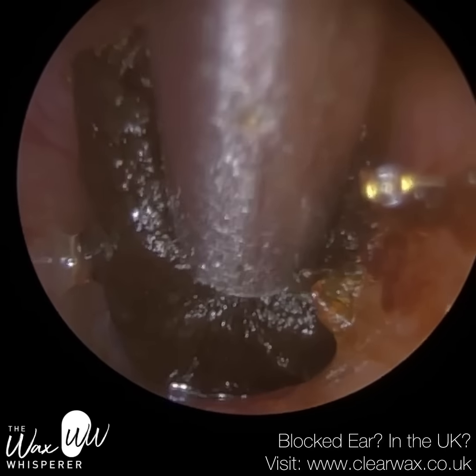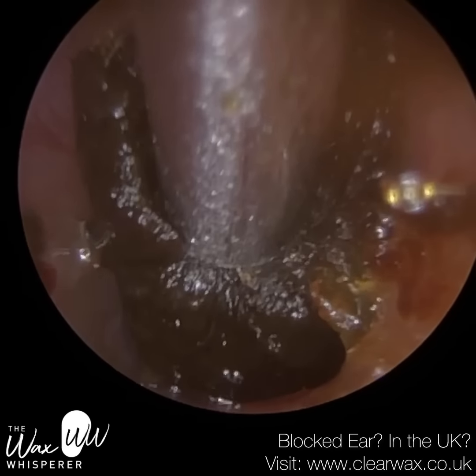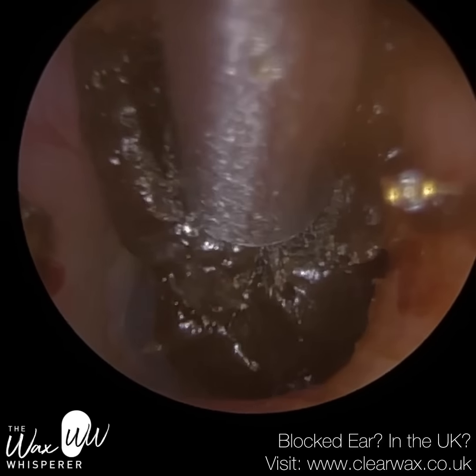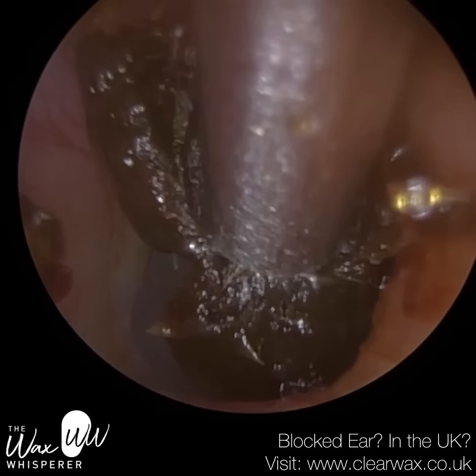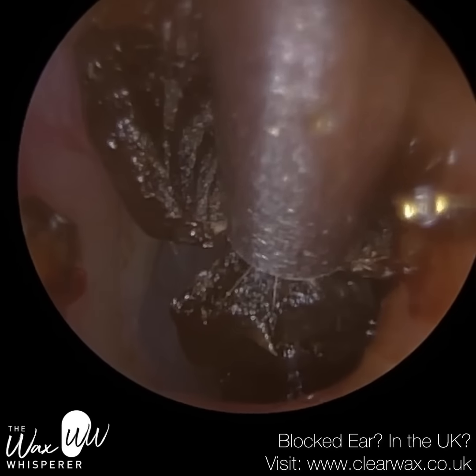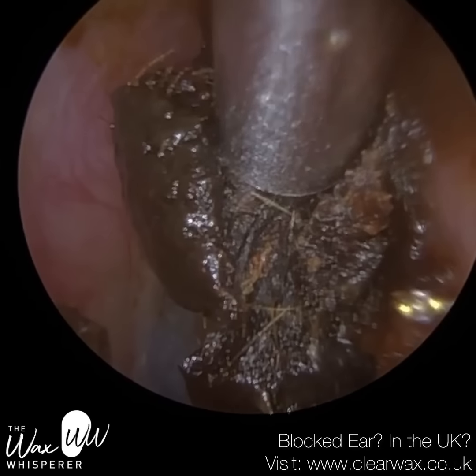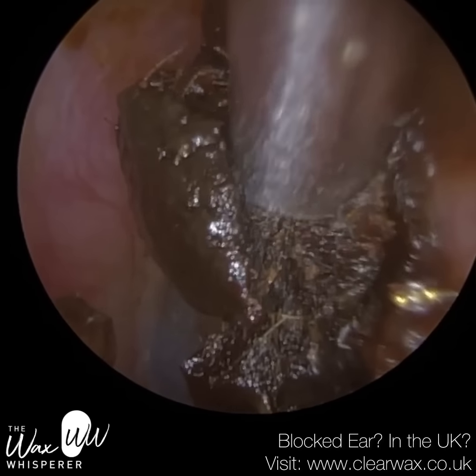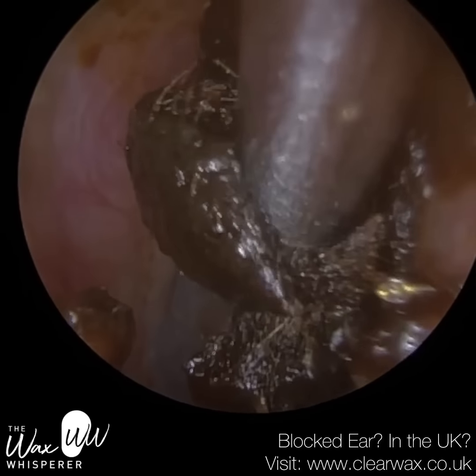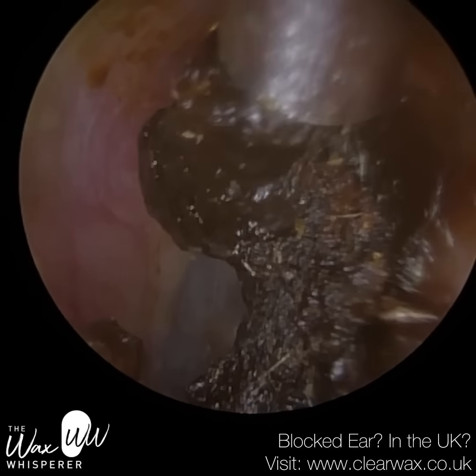This wax is lodged in the isthmus — the narrowing towards the eardrum — where the ear canal narrows and widens, creating a recess or valley at the base. I'm getting it out from the bottom of the ear canal and also from the front. Whenever you see earwax lodged like this, you make the assumption that this patient has been using some sort of Q-tip or cotton bud, or they could be a hearing aid wearer, or wear ear defenders, swim plugs, or sleep plugs — it's been pushed and lodged in.